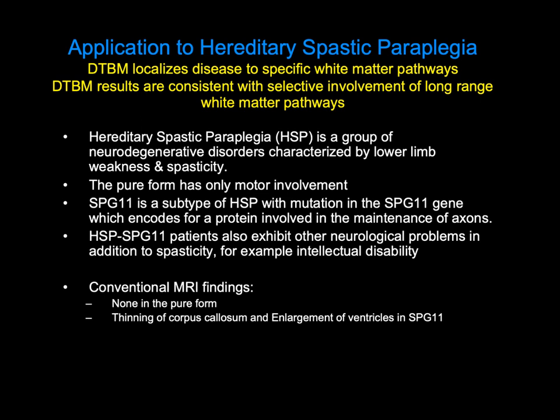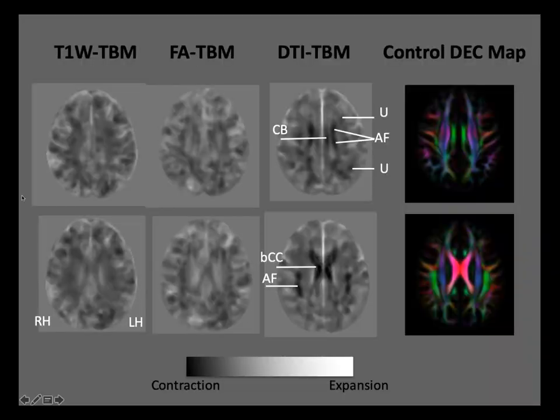So the bottom line is that it manifests itself mostly as a motor disease, because the motor neurons are the ones that have the longest connection, right, from the cortex down to the spinal cord. So in this venue, you can hypothesize that probably white matter is not affected the same way, but that longer fibers are more affected than shorter fibers. And here you can look at the determinant of the Jacobian map. Remember that where you see dark, it means that patients had smaller structure than control.